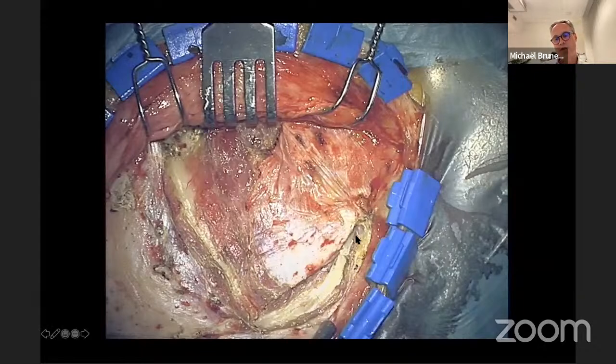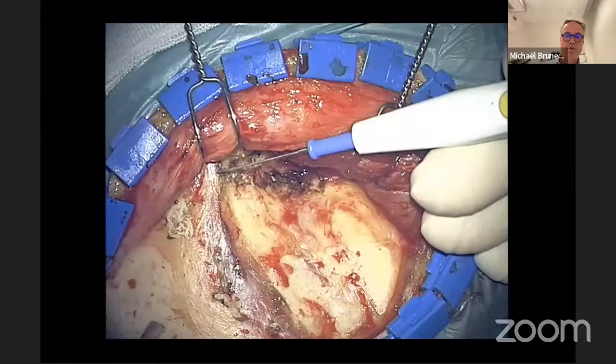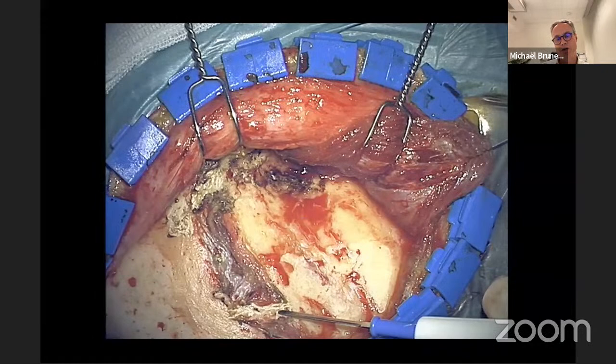The posterior incision is made along the sense of the fibers in order to disrupt the nerve as little as possible. And as explained by Stéphane, it is important to respect the periosteal fascia below the temporal muscle in order to preserve its vascularization and innervation. This elevation is truly important to protect the muscle. Then, for placing the craniotome, I just made a small anterior incision in the muscle and a small posterior incision.